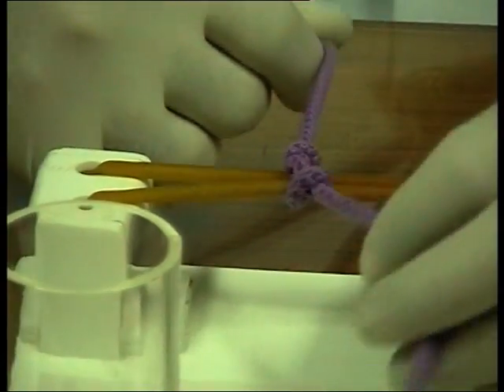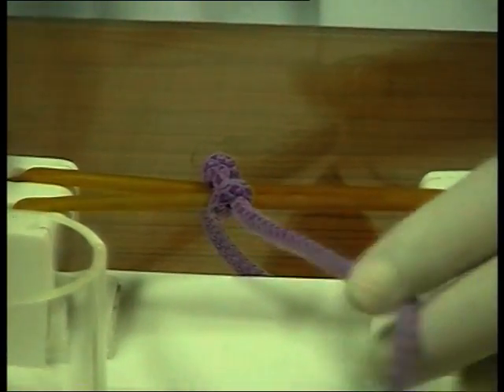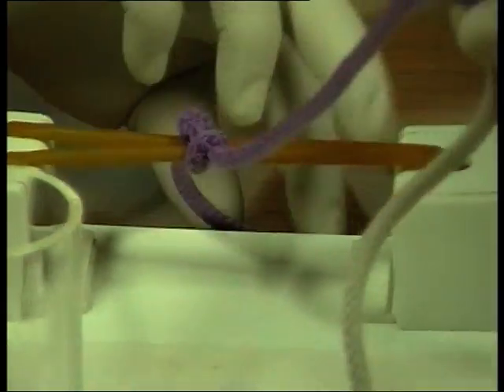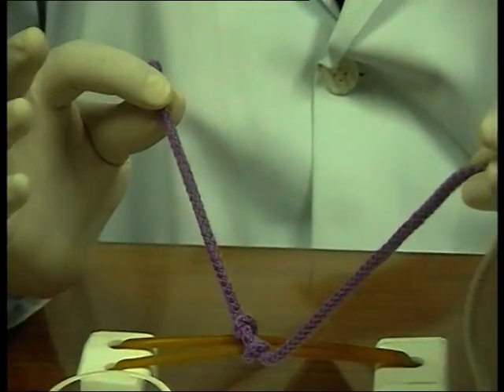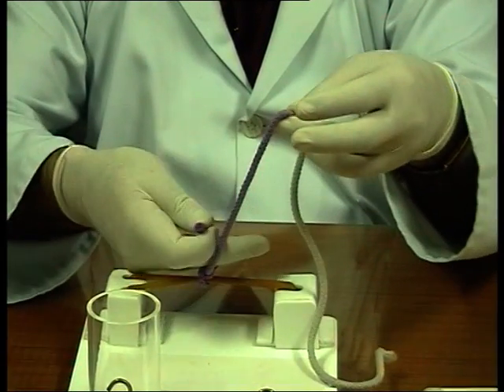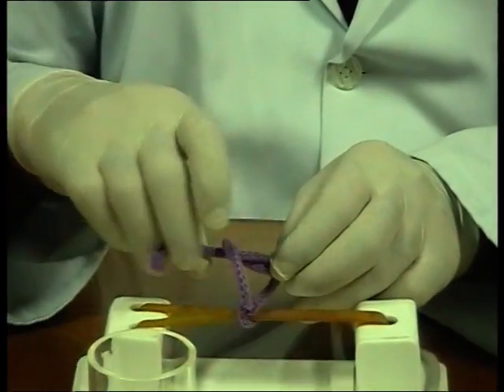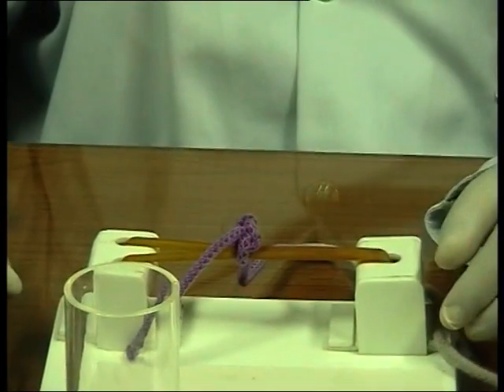Okay, now the short end is towards me. The long end is away from me. Which finger am I going to use? Middle finger. So I'll hold the short end between the index finger and the thumb, like a dart. This one like before, I wrap it around my 3 fingers, bring the other one right across, hold the end section, and use middle and ring to cross back. That's called a surgeon's knot.